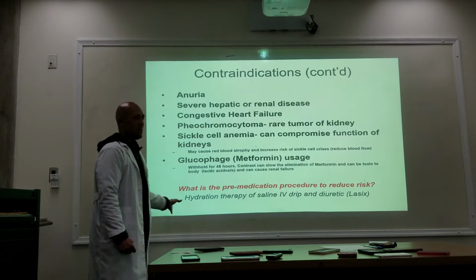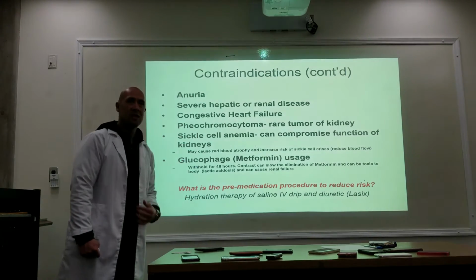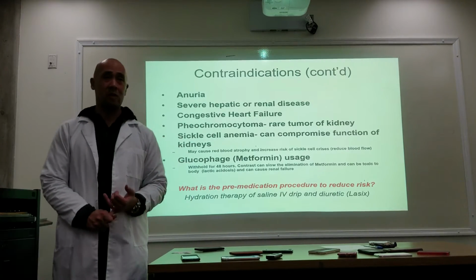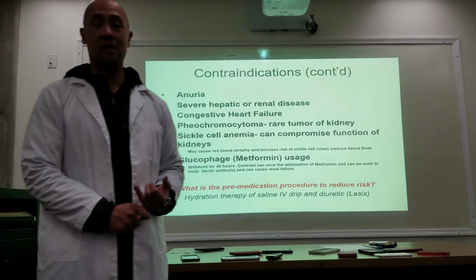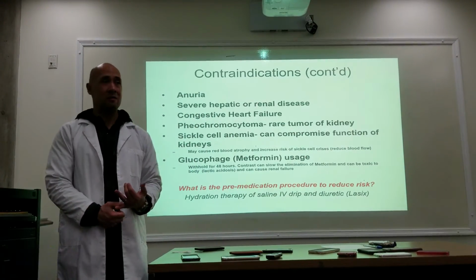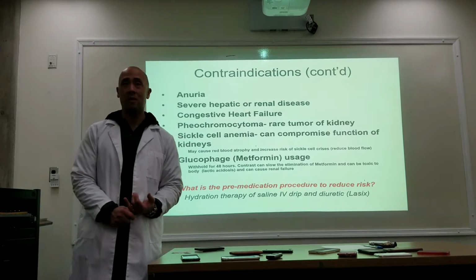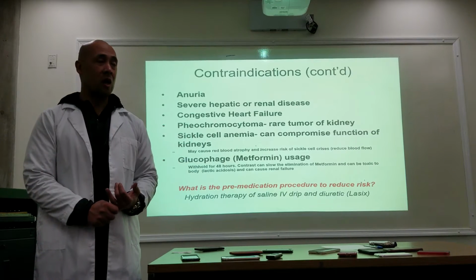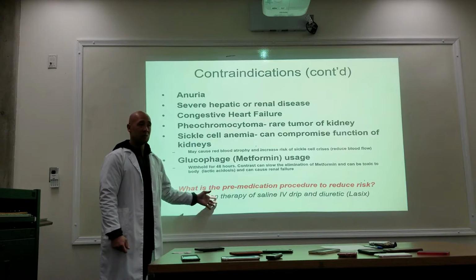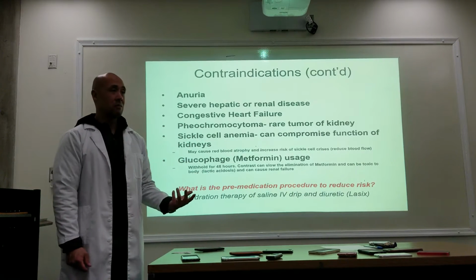What is good to ask is that usually patients who have a procedure like this, the pre-medication that we ask them about is if they had any type of Benadryl or steroids prior to having them come to the department. You guys remember what Benadryl is? Antihistamine. And what is steroids? What do they do? Muscle relaxer to counteract any type of muscle contraction as a response to the contrast. So those are the things that we need to ask them. Did you take your Benadryl?